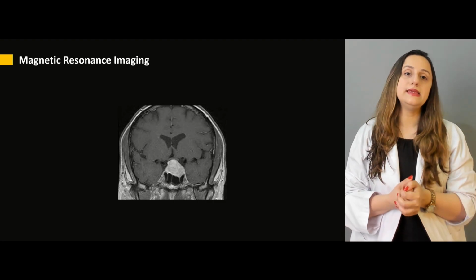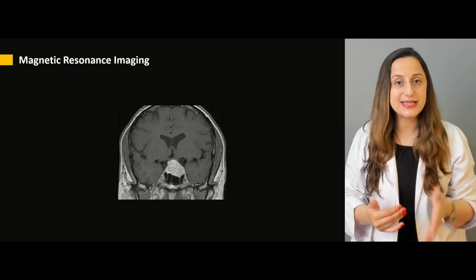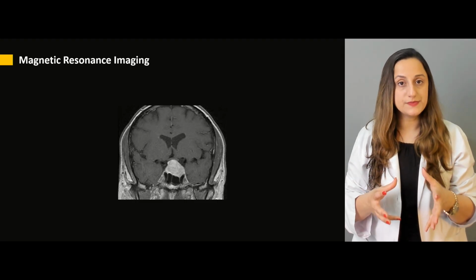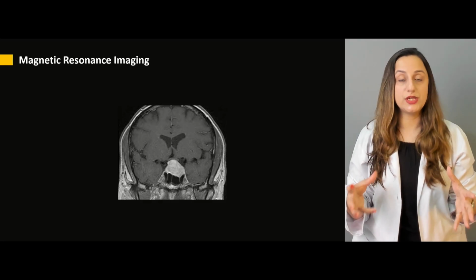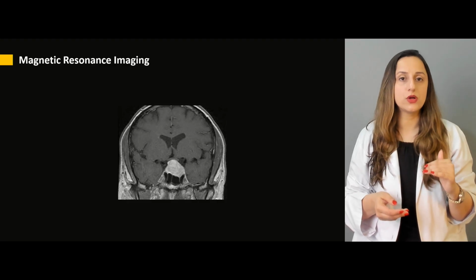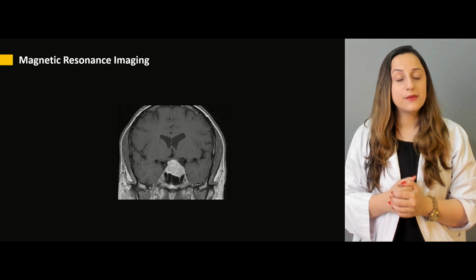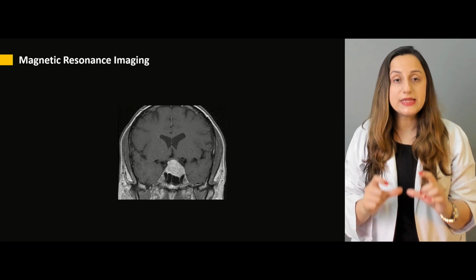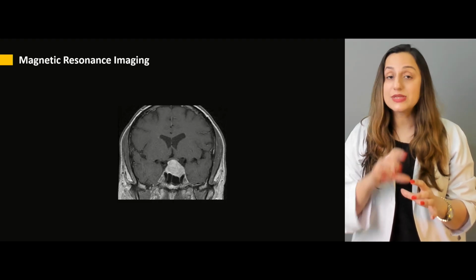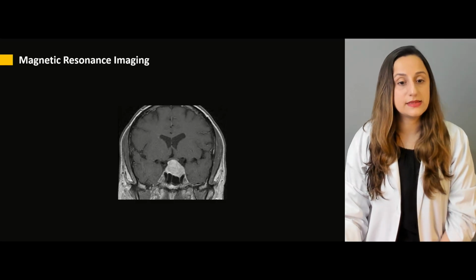And we can basically have the coronal sections as well as the axial sections. There is going to be a sufficient amount of exposure, symmetric kinds of radio imaging techniques are going to be used, and thin slicing. For instance, almost a 3 to 5 millimeter slicing technique has to be used because we're dealing with a very small lesion in that particular area. So it has to be quite thin sliced CT scans and MRIs in this particular case.